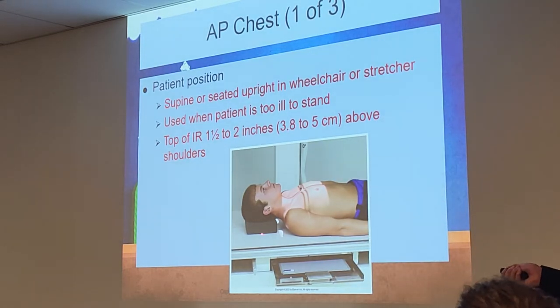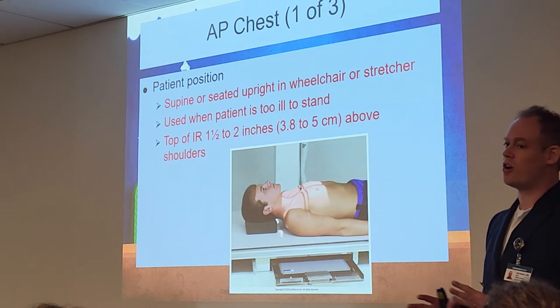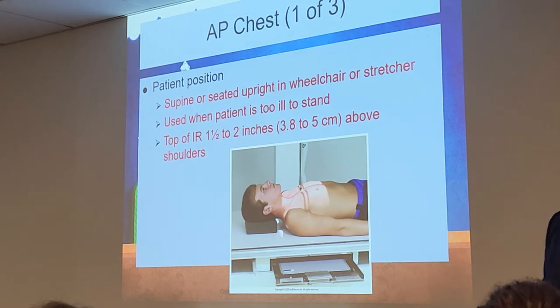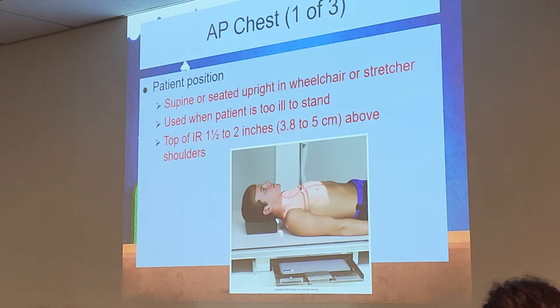Mr. Mannequin here, he had a little special pillow. That's one of those radiolucent sponges? That's a radiolucent sponge, yes. Cool. But those aren't readily available everywhere you go, unfortunately. They're very expensive, actually. It's hundreds upon hundreds of dollars for even a small one like that. Yeah, medical equipment, they jacked up those prices. You know, it's probably made very cheaply.